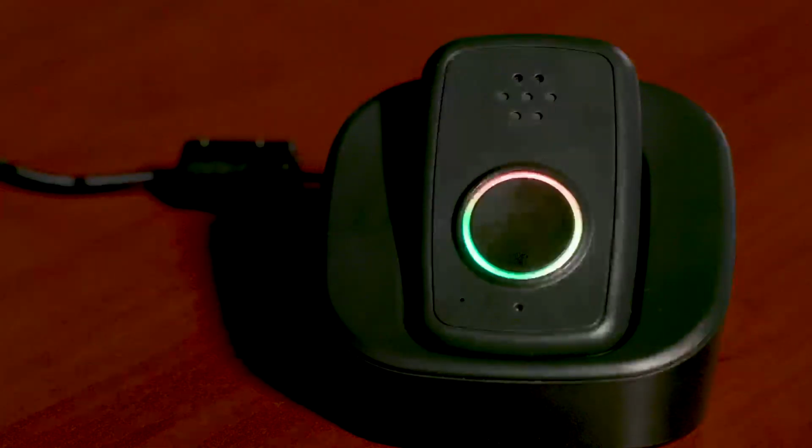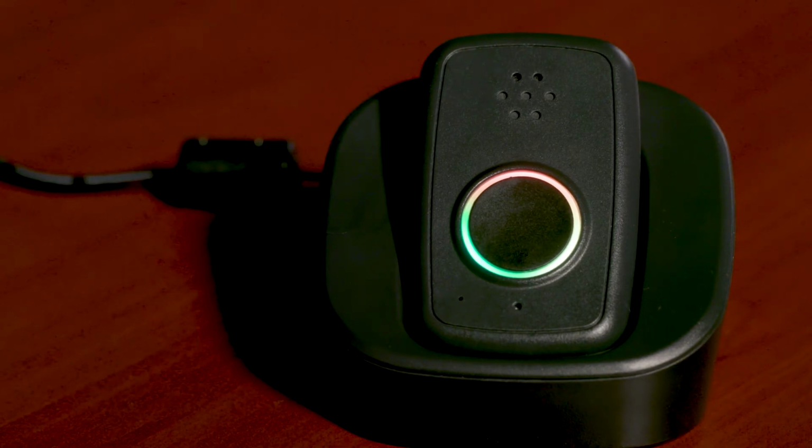It will take about 30 to 60 seconds for the device to connect to the cellular network. When it does, it will announce, "System ready."